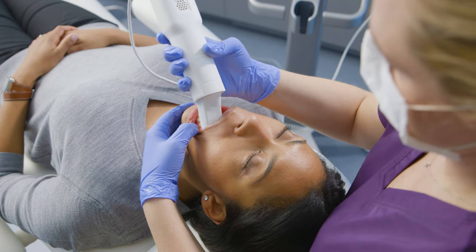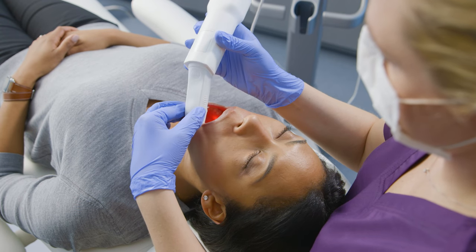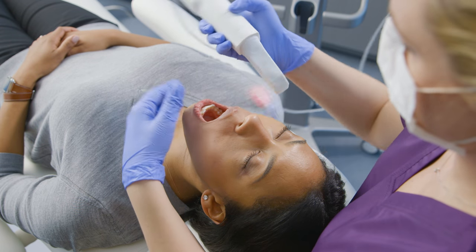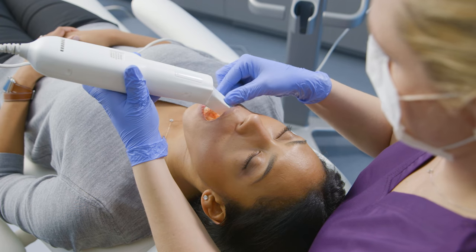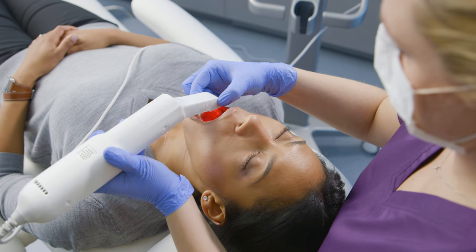I follow the arch with the wand as I move toward the anterior. At the midline, I will remove the wand from the patient's mouth, place it on the occlusal of the contralateral terminal tooth, roll to the buccal, and follow the arch around to the midline.